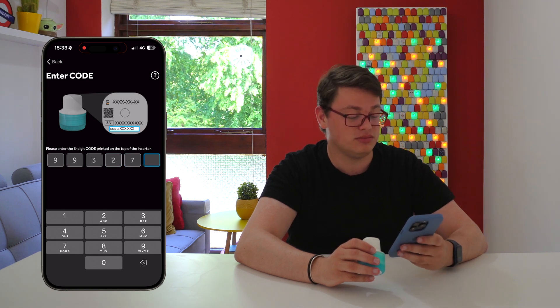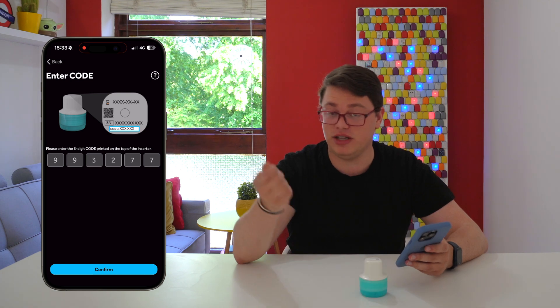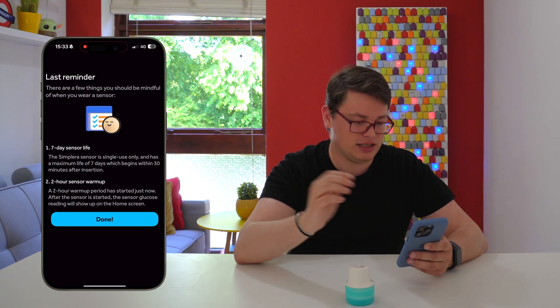Now on a Dexcom G7 you don't actually physically need to type it in — you can just scan the QR code on the sensor to do that. Here you have to type it in, which is not ideal. And the sensor is paired.